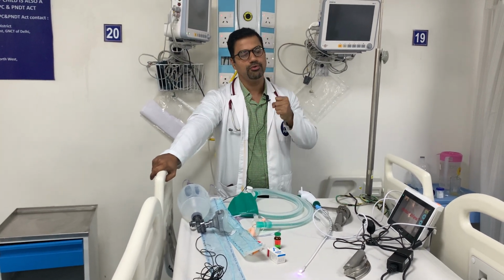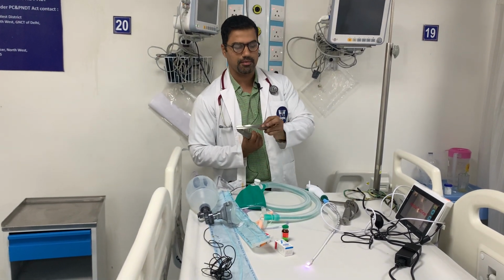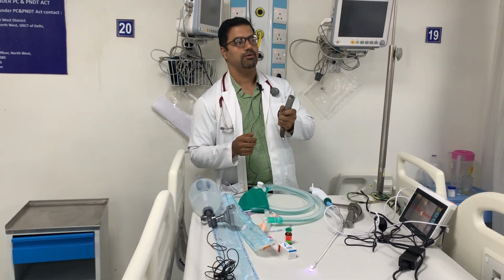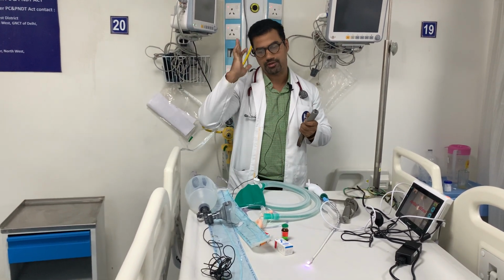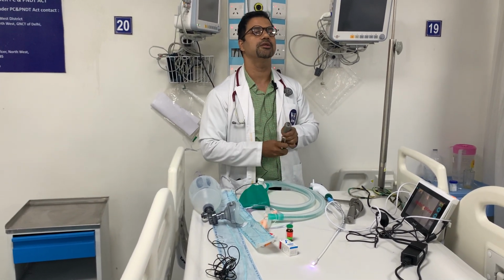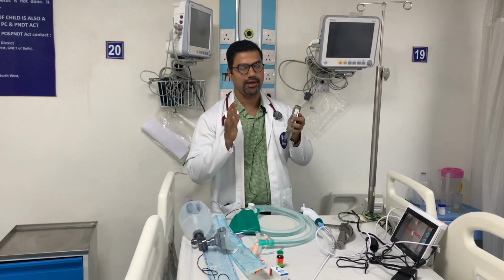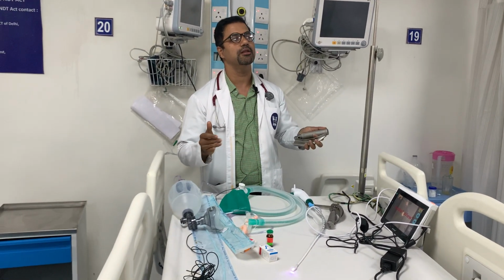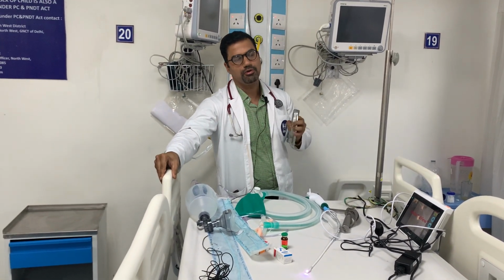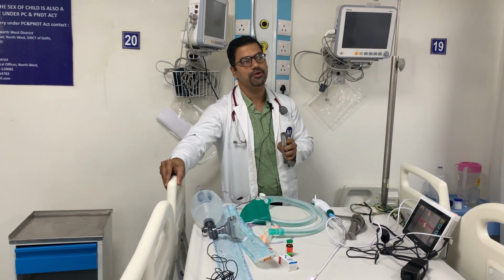The moment you do the check laryngoscopy, this is the laryngoscope, as I tell you, always check the light and the blade first, and then do a check laryngoscopy. If you can visualize the vocal cords, fair and well. If you cannot visualize the vocal cords, don't give the paralyzing agent ever. Because if you have a helping hand, fair and well. If you don't have a helping hand, the patient can go into respiratory arrest and could not be revived. So always think twice.